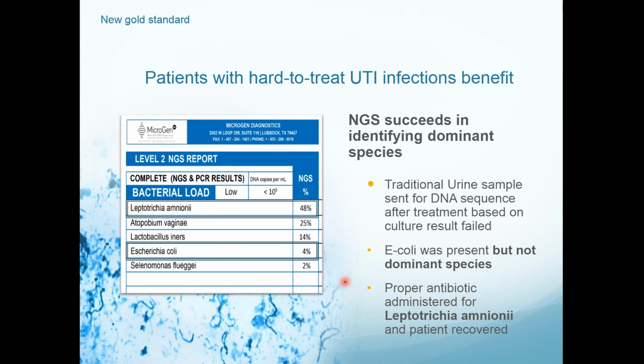All right, here's one of my patients. It's a 72-year-old patient, 3 months after a penile implant.